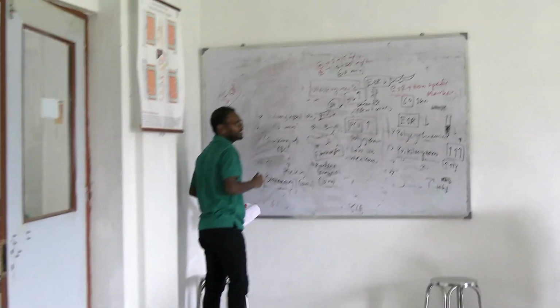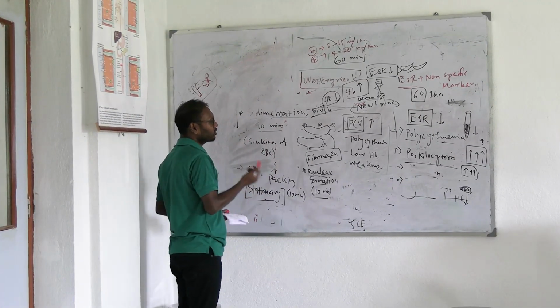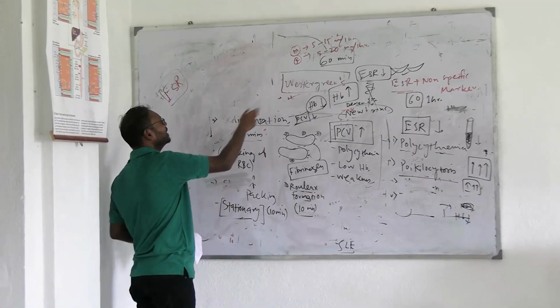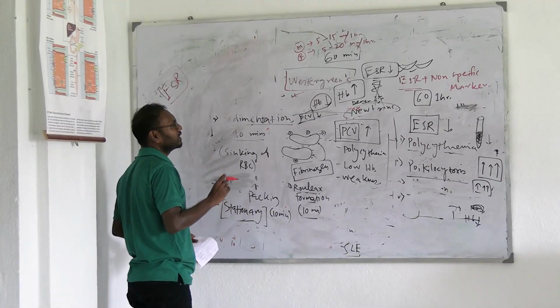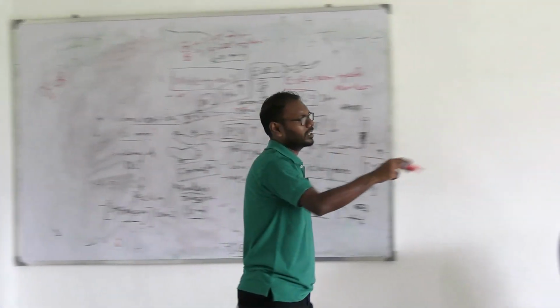Mainly we'll be focusing on ESR, but since we'll be talking about ESR, these two are interrelated, so we'll also be discussing PCV a little. So in this case we have two kinds of tubes already kept in front of us.